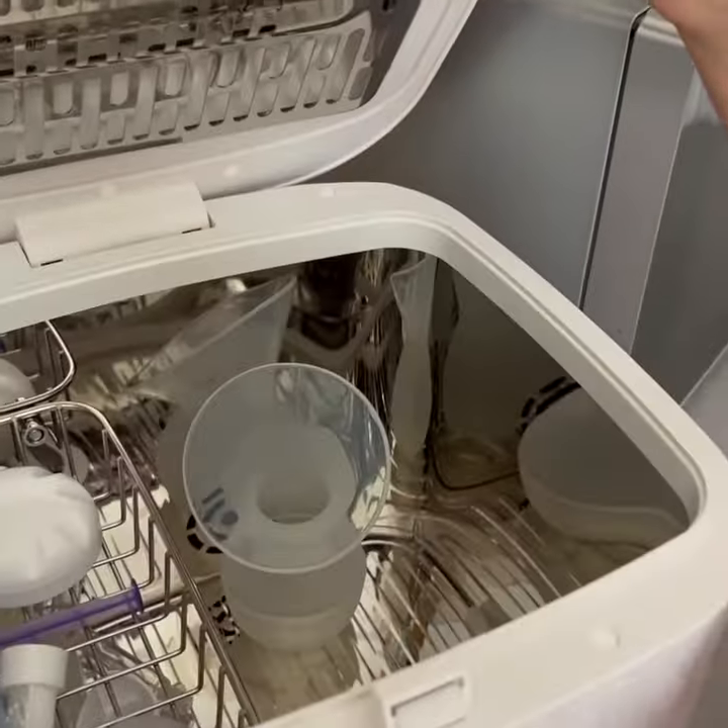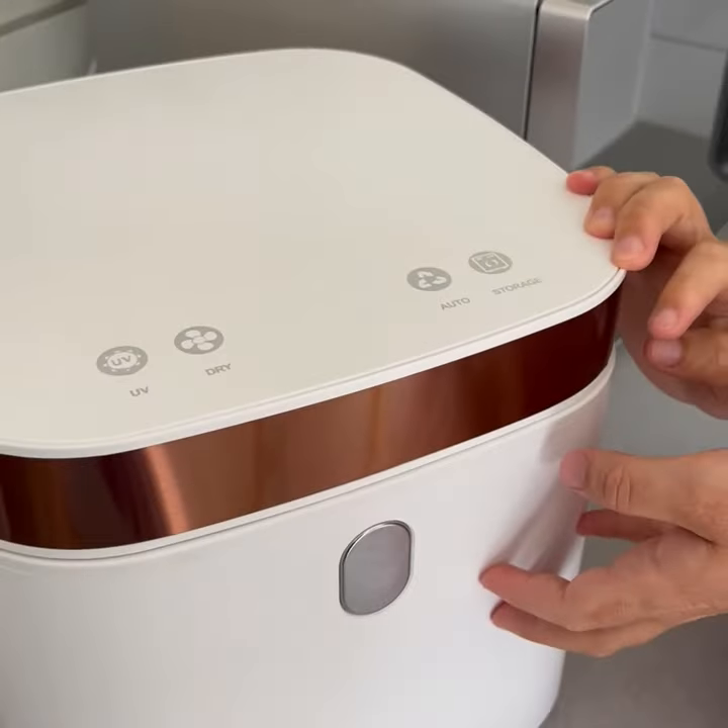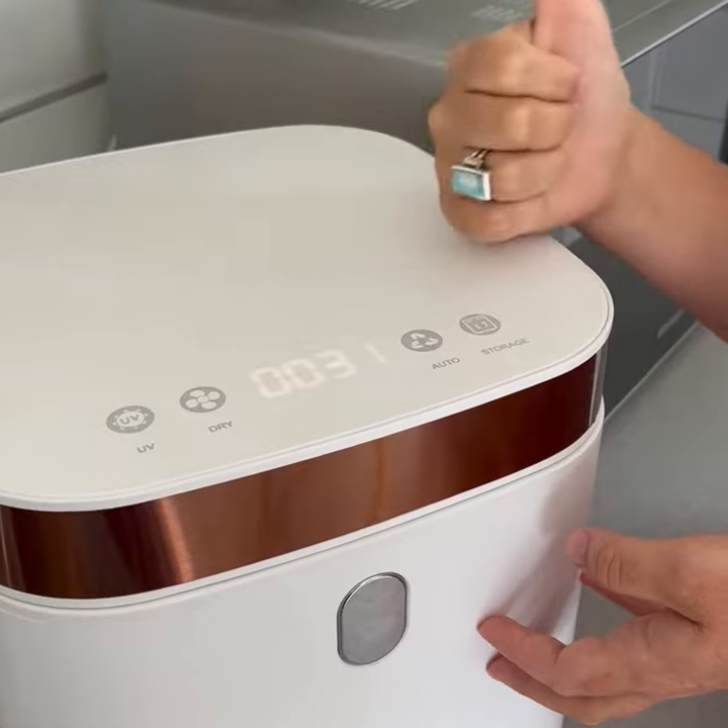If you are placing wet items into the unit, we always recommend to select the auto mode to both dry and sterilise your items.